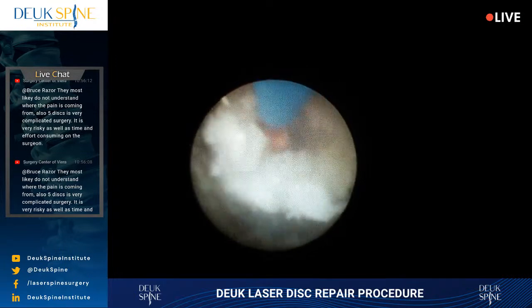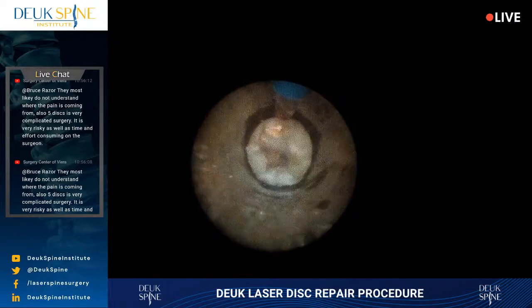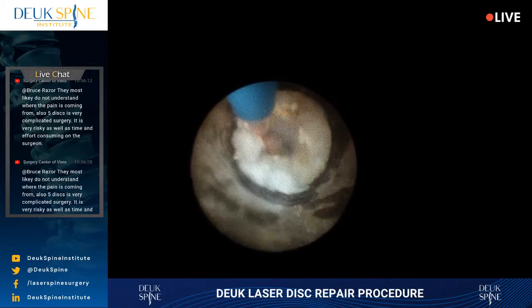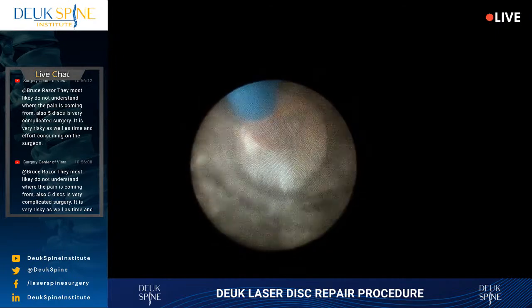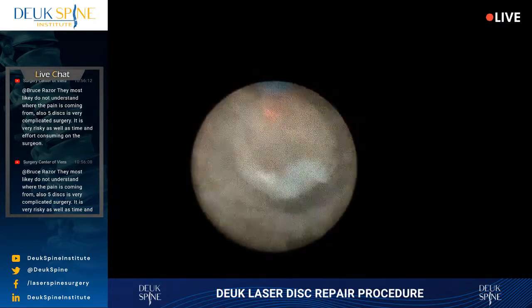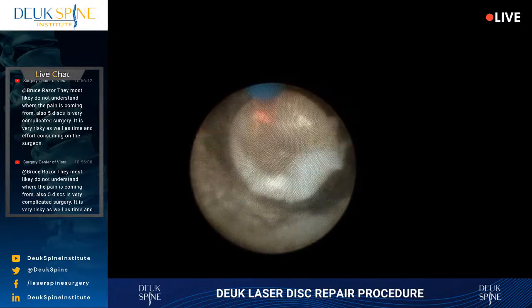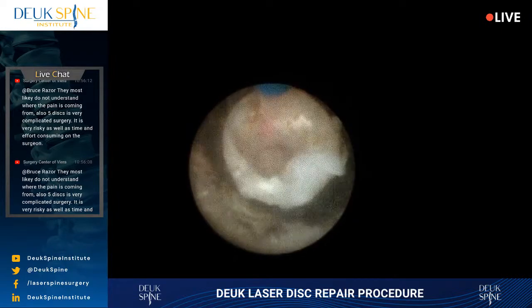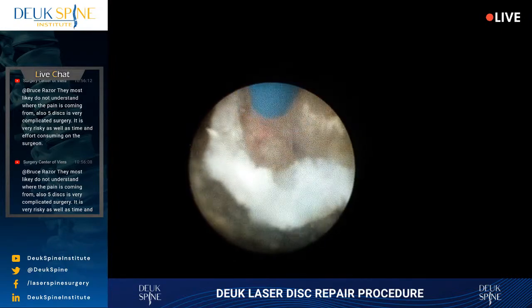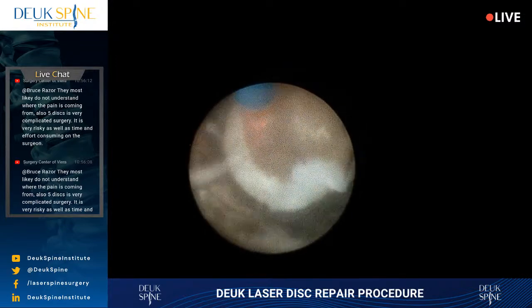It's got calcium. That's what happens when the laser energy hits calcium. It turns golden. So calcium in tissues. We call this dystrophic, spelled D-Y-S-T-R-O-P-H-I-C, calcification. It means that your body's response to bad tissue, damaged tissue, is to calcify it and scar it for whatever reason. Nobody really knows why, but that's what happens, okay? I don't make the rules, I just follow them.